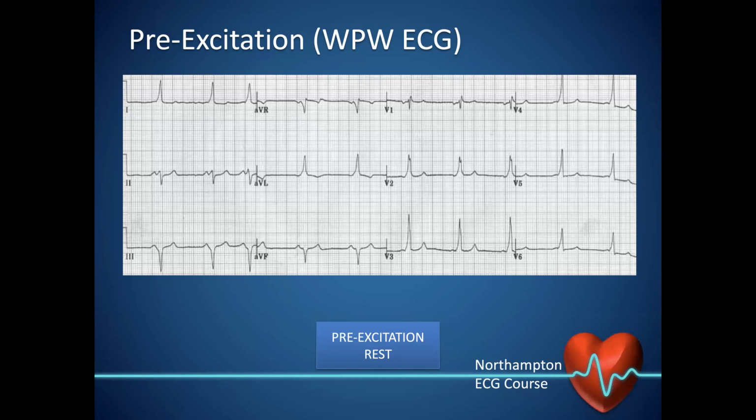Yep, good. The next question is on the issue of coronary sinus focus. Dr. Timperley, if there is a focal point from the coronary sinus, is there any difference in the P wave compared to a focal point coming from any point of the right atrium or the left atrium?